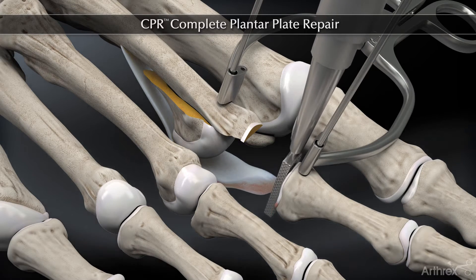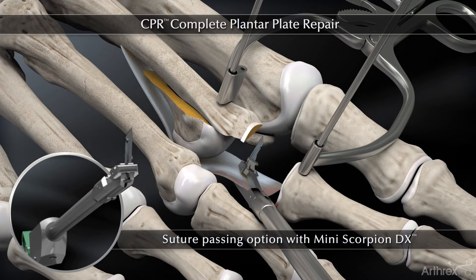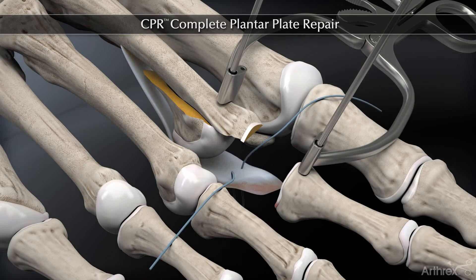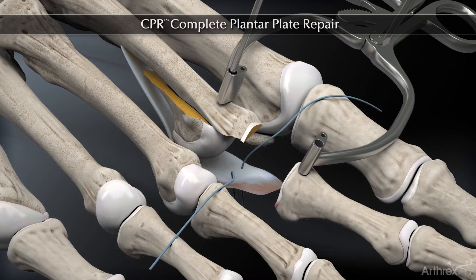We roughen the insertion site, and then using the microscorpion, we pass a suture through the plantar plate, creating a horizontal mattress suture. Another way is to use the pigtail or microsuture lasso in a tight space or if you have a longitudinal tear.